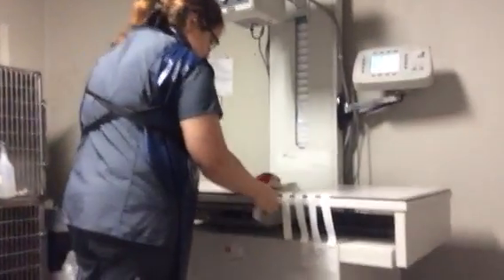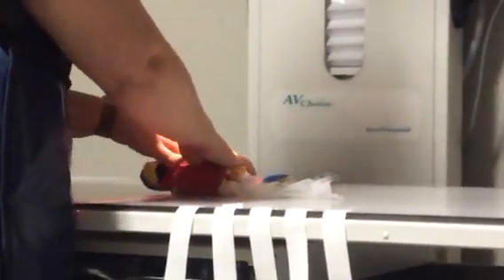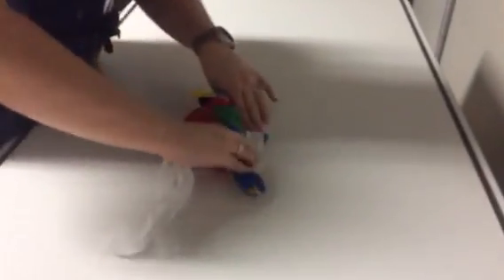Slide it in. What do you want to do? These are left and right angles. I'll take it smaller. If I want to do a lateral, I'm going to tape down the wings on the side. Tape down the wings on the side for a lateral.